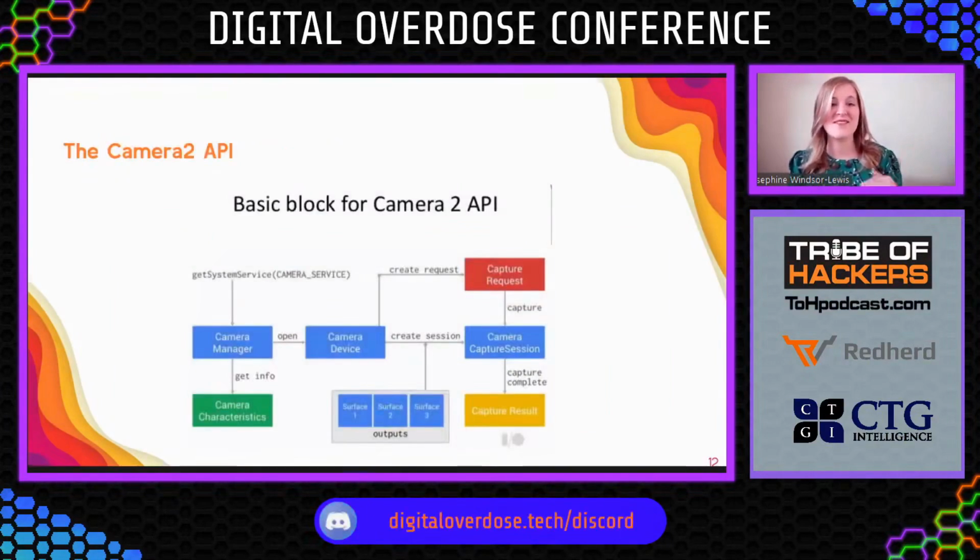Nope, got to build it. We decided to use an Android interface because you have way more control over the camera. They've got this handy Camera 2 API, which is a fairly recent release. It's an application programming interface. It's basically a framework, a bunch of functions programmers can use to build their own apps.